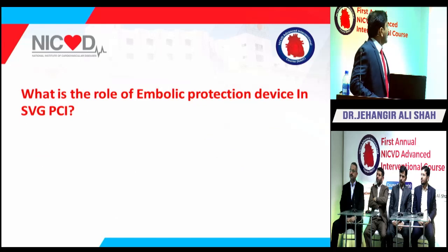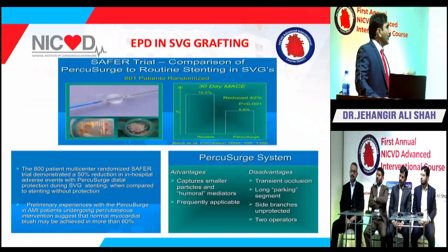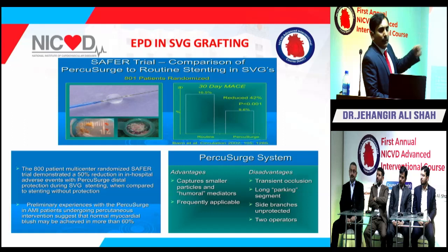So now we have to use embolic protection devices; what is the indication? The SAFER trial was published in 2002. Embolic protection device initially was a class 1 indication.